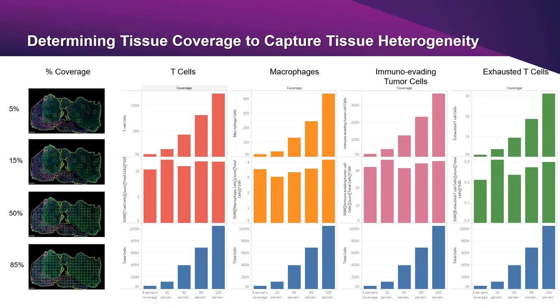More and different samples need to be run, and the region size of interest adjusted to a smaller field of view to better reflect the TME core sizes. But at least this is an interesting start of what we're attempting to do.